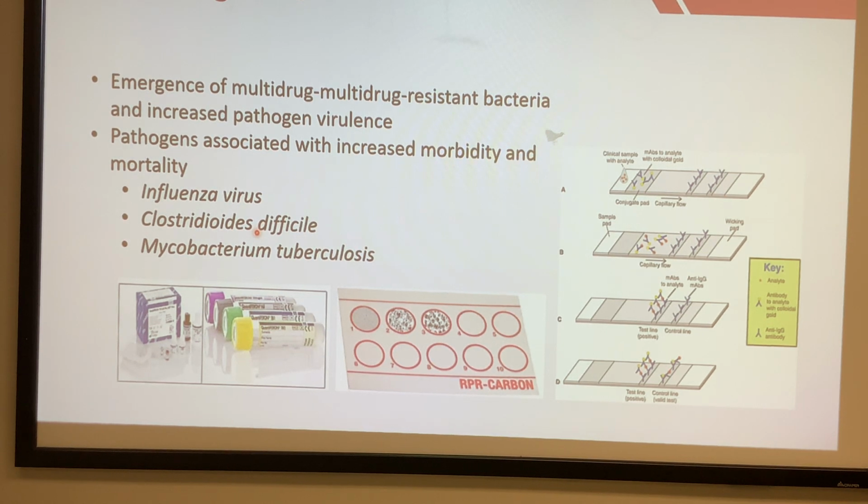We can return a brief, preliminary result to our physician or care team as soon as possible. So these tests are more designed for clinically heavily interested organisms like influenza, COVID, and C. diff, or mycobacterium. For other things that are not that crucial for turnaround time, you won't really use rapid diagnostics because they have relatively low sensitivity and specificity.